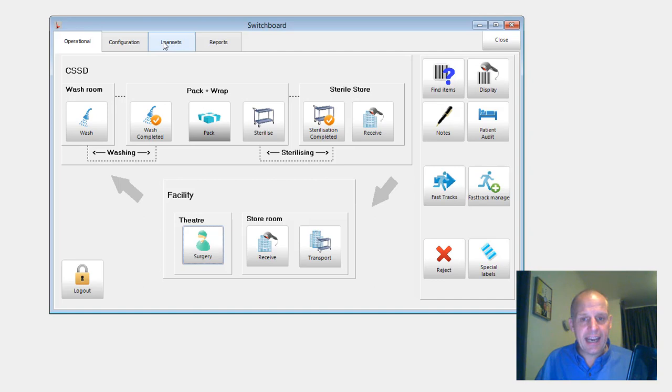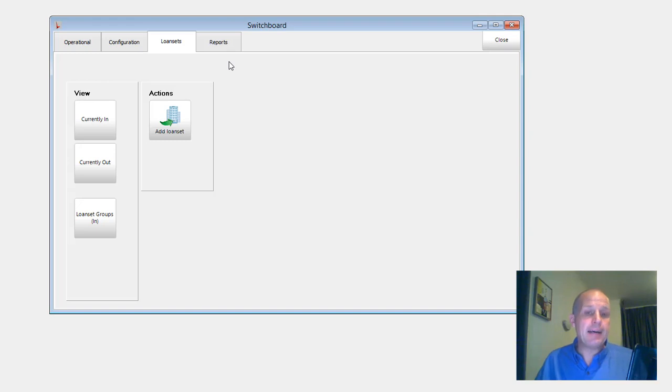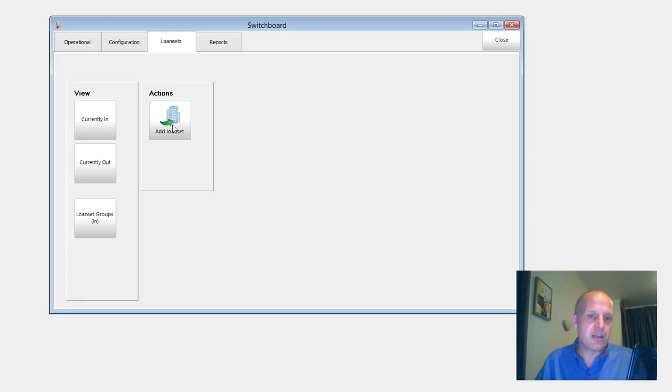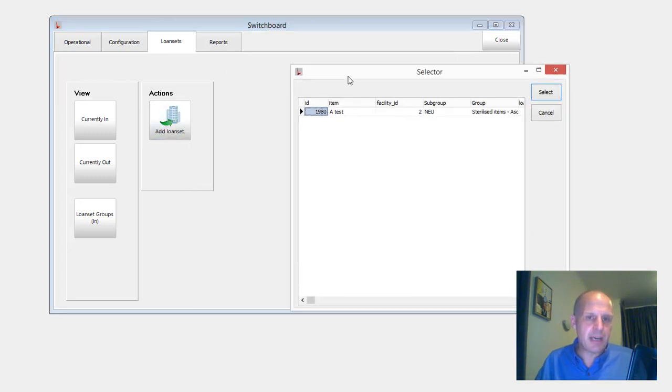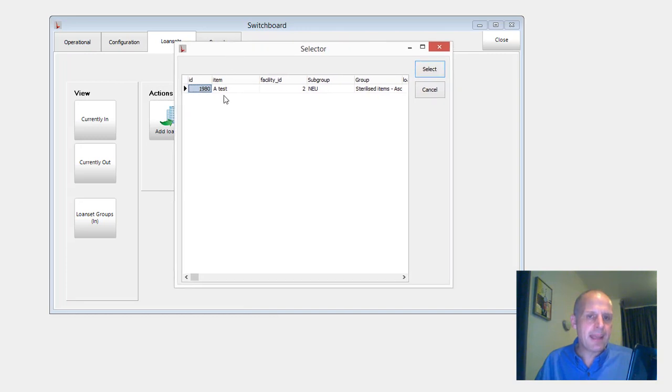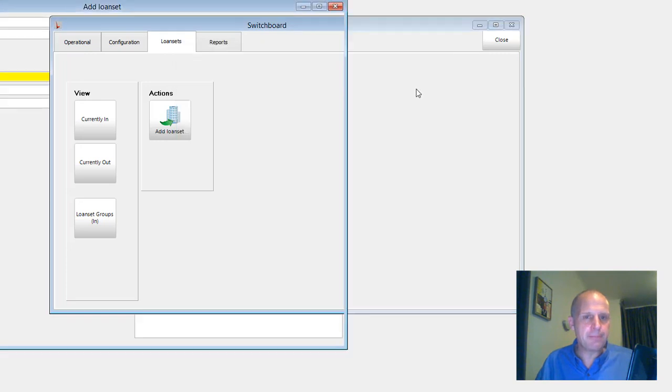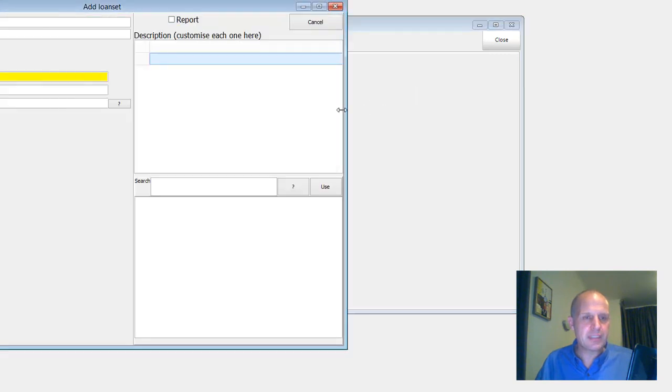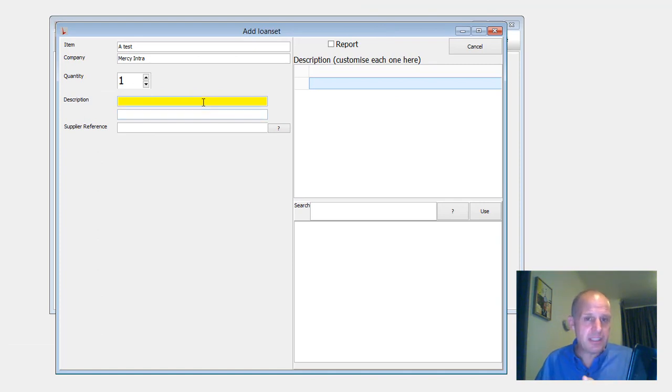The other big change is loan sets. Now, I introduced this concept at St. George, so they've half seen it. But what I've really tried to do is streamline the loan set process. So you have this new button, which is add loan set. It'll give you a list of all your loan set providers. So you select your loan set provider.